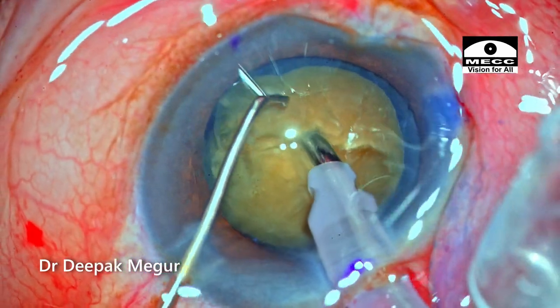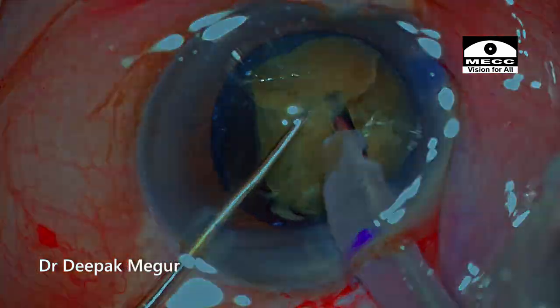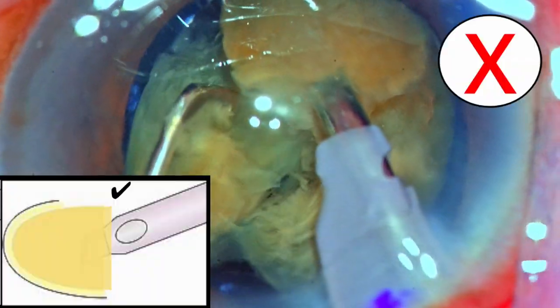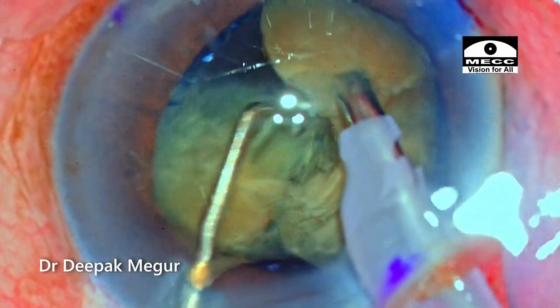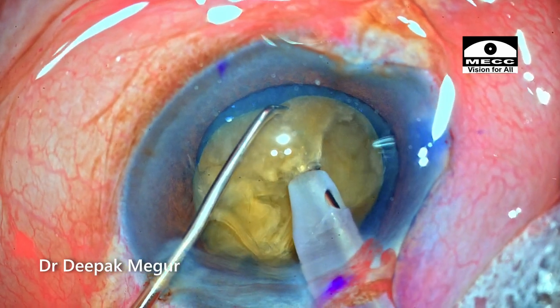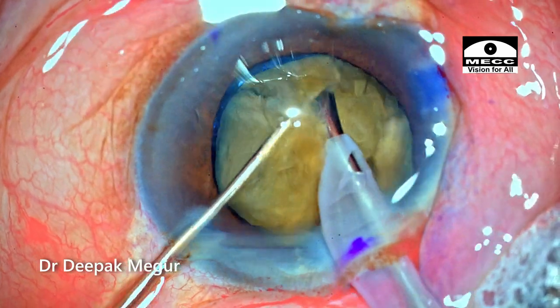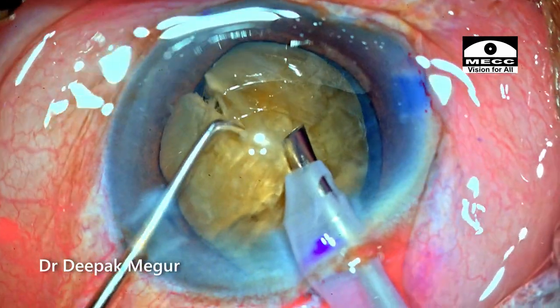Moving on to the next chop, the tip is buried and as the horizontal chop maneuver is performed, I notice some torque — commonly seen when dealing with a slightly denser nucleus. This could have been minimized if the phaco tip had been buried deeper into the nucleus substance. For the next piece, I consciously bury the tip deeper, and the chopper engages the endonucleus with no torque. Suddenly the patient coughs, causing a jerky movement.